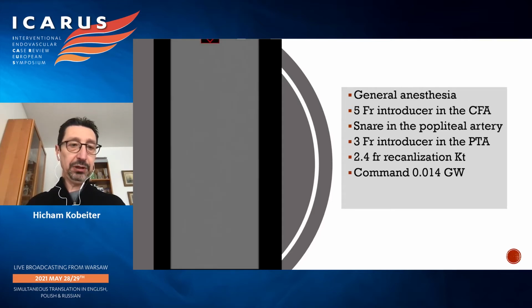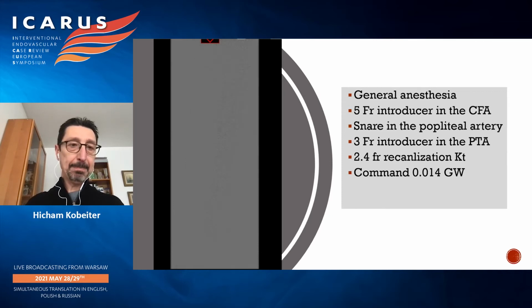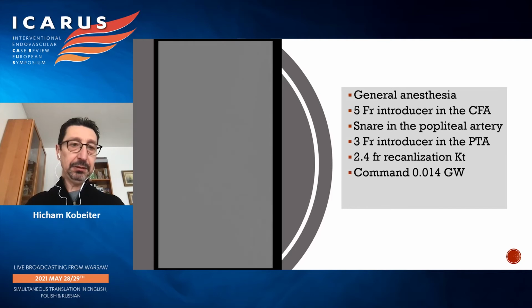and you're going to see the angiogram very soon. Here is the first angiogram. We see that the origin of the tibial artery was higher than this branch. It was probably a collateral, and the flow was not so good because we probably didn't dilate the distal part of the posterior tibial artery enough. And here is the distal control.